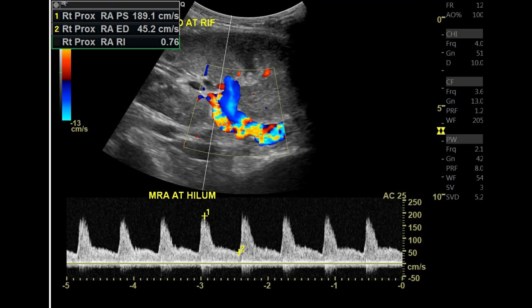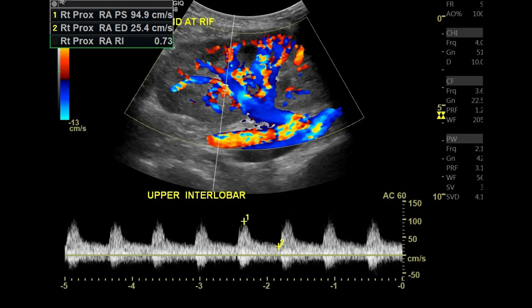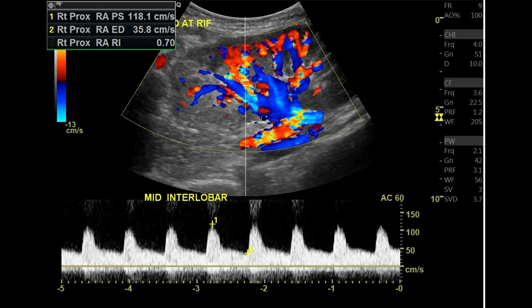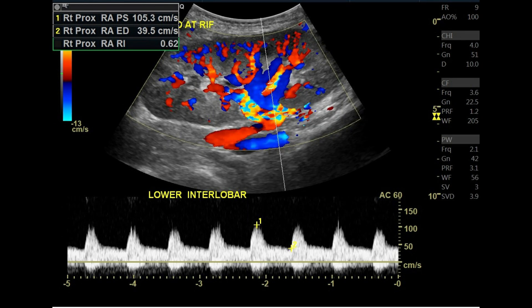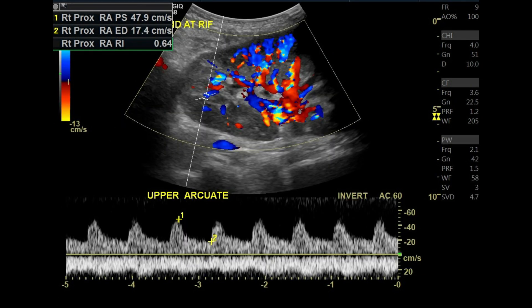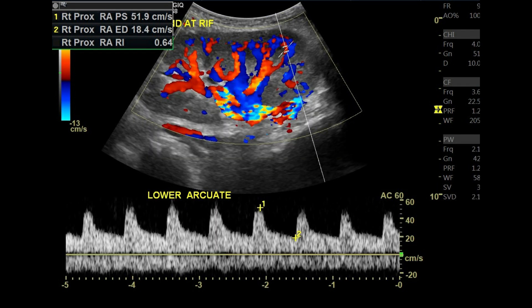At the hilum, we start to take the resistive index, which should be between 0.55 and 0.79 — this is the normal range we use. The main renal artery shows a normal resistive index. Then we scan the interlobar branches at the upper, mid, and lower poles, and then move to the arcuate artery at the upper, mid, and lower poles of the kidney.